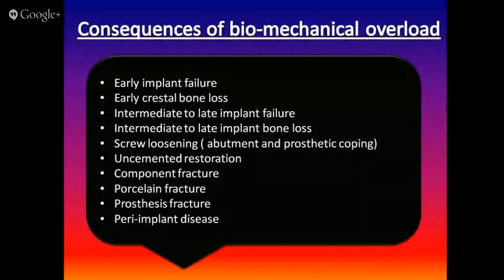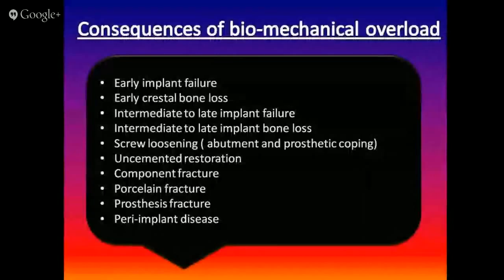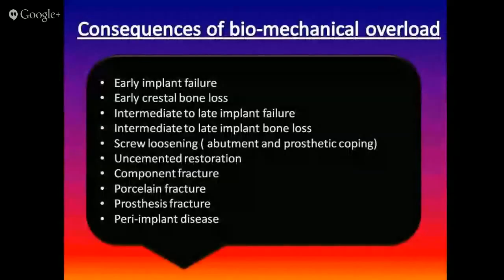We've taken utmost care to give a passive prosthesis, but we have neglected the overloading factors. In spite of taking care all throughout, I have neglected one step and I land up with complications. So the neglected step can itself be detrimental to your long-term success.